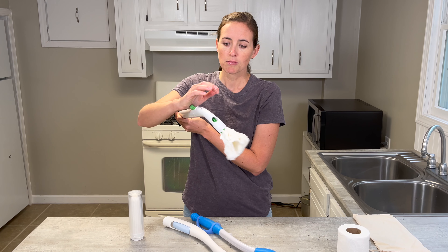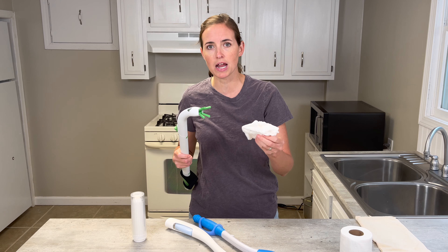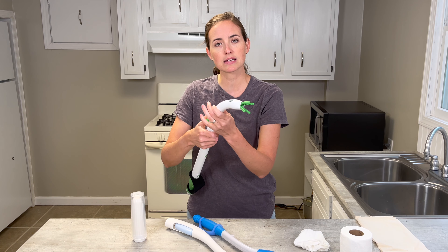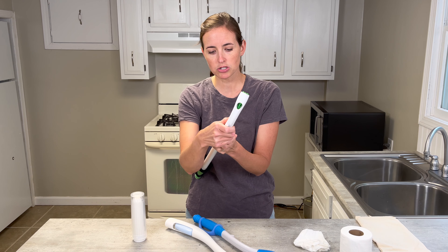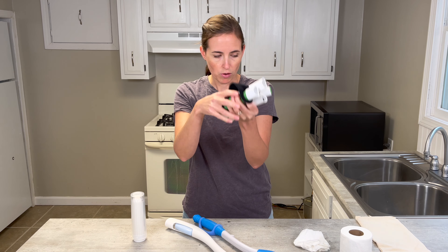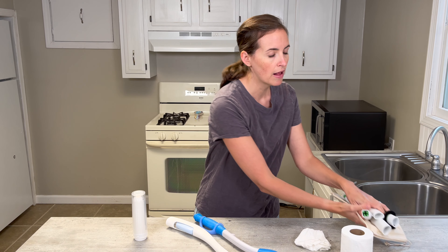To release it, you simply press up on the mechanism and the toilet paper falls right out — really convenient, with no touching of the toilet paper. It does need to be cleaned; it has an opening and the pieces come apart for easy washing with soap and water. It comes completely apart and fits inside a transport pouch, so even in its longest form it folds up relatively small and can be brought with you.